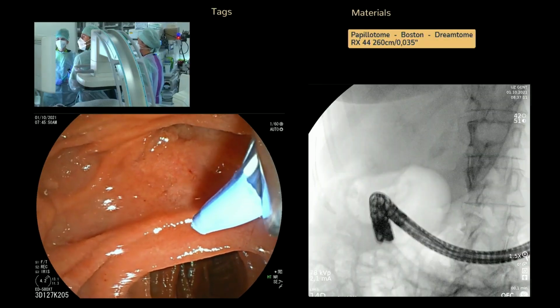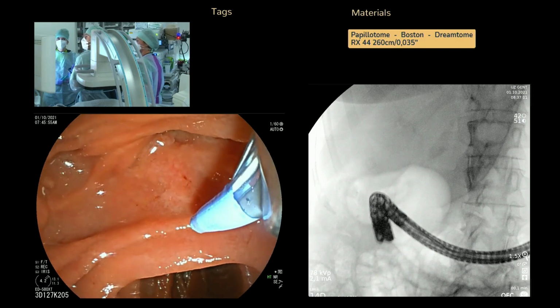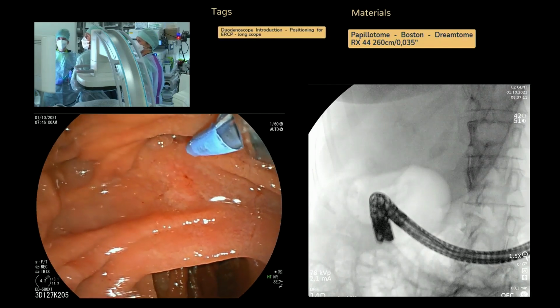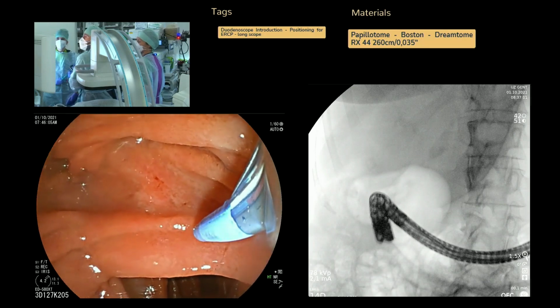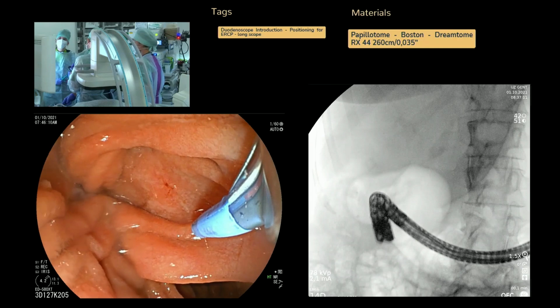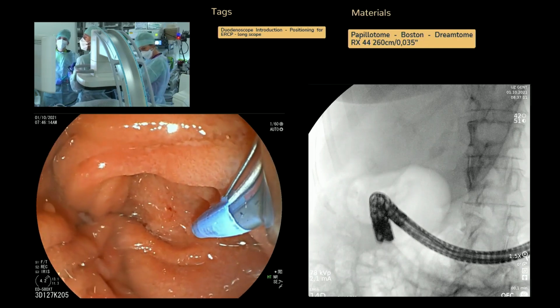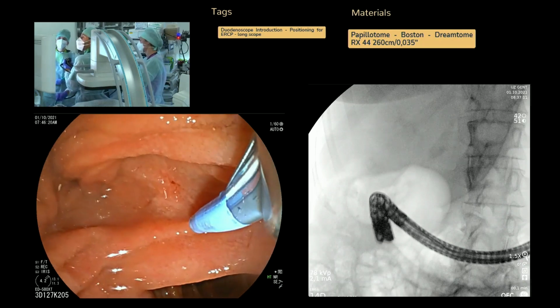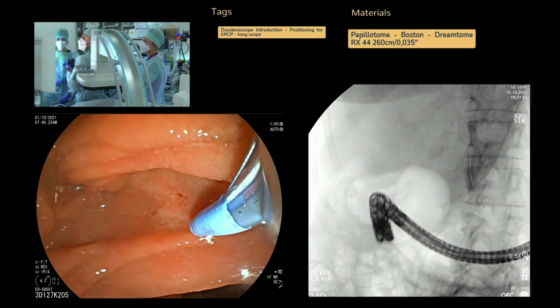How do you teach the fellows to cannulate? What technique do you use? For the couple of cases I've done, I do the movement outside of the papilla to be sure which way it will go. Do you start only with the wire? We were discussing cannulation techniques, and I was wondering what people are being taught here. Is it purely wire, or is it a combination of cannula and wire? Do you touch the papilla with your cannulotome? Yeah.